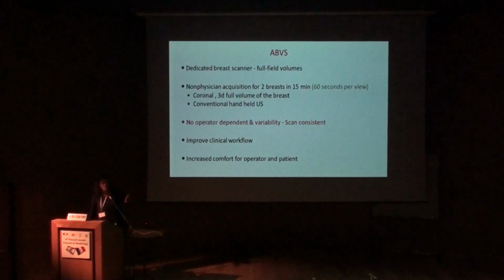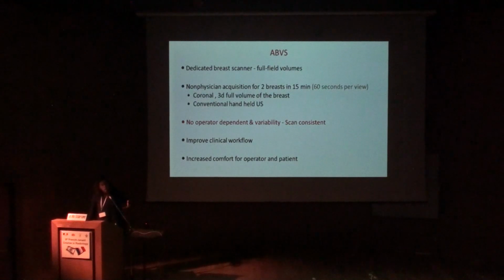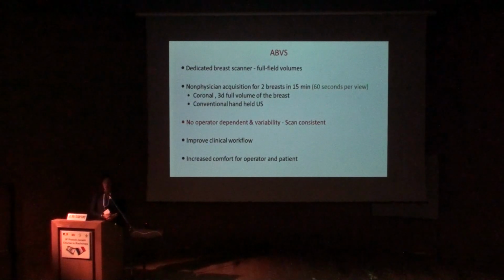And the advantage is that it is performed by a technician. Breast ultrasound is very operator dependent, so in this case, the study is not operator dependent, it is a quick study. All the images are stored in the computer and can be viewed later. It is possible to do a reconstruction. No doubt that in the States, for example, those systems are replacing the technicians. Unfortunately, in Israel, we are not using it so much.